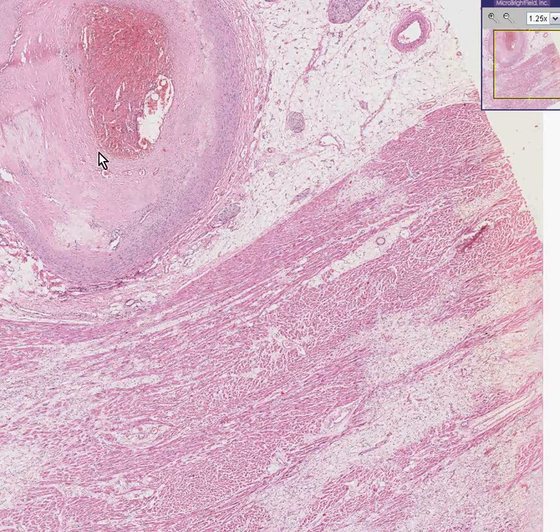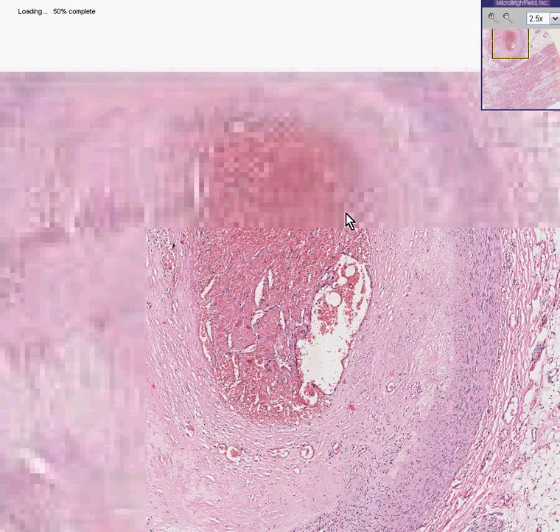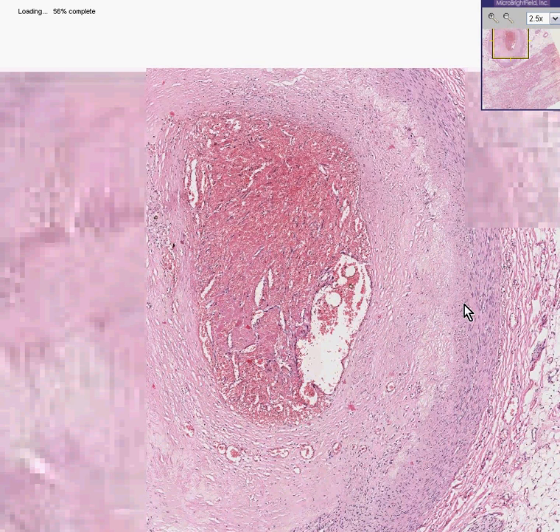So let's try to be logical, and let's say that this is a large artery. You could already see that most of its lumen is obstructed. Most of the reason for the obstruction is atherosclerosis. You can see that there are perhaps small areas of calcification. This is all plaque and fibrous tissue and foamy histiocytes. Here's some residual portion of smooth muscle of a large artery.